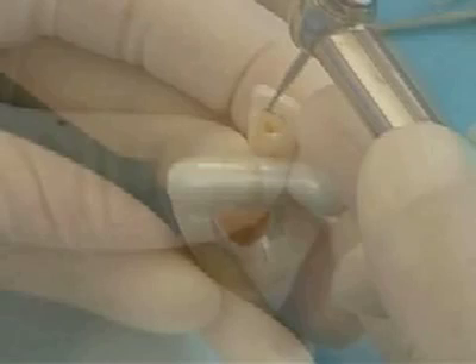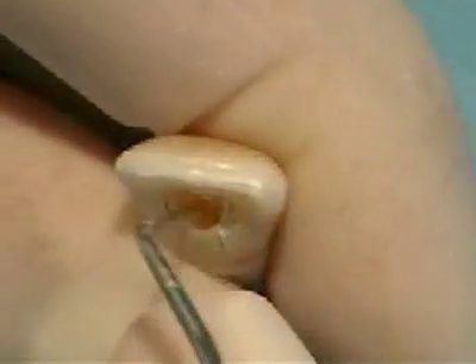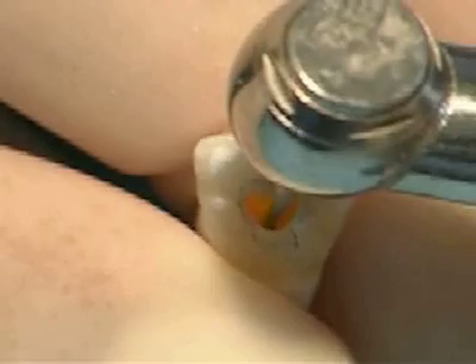Use the endodontic explorer to check for the canal. If the explorer meets constant resistance, the pulp chamber has not yet been reached. Continue drilling apically through the dentin. You will feel a slight drop as the burr breaks through the roof and drops into the pulp chamber.